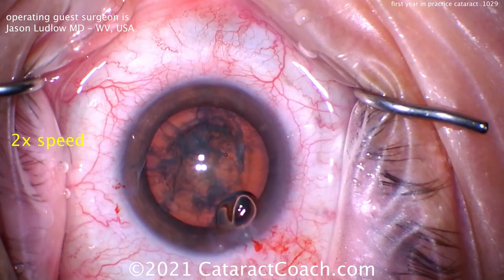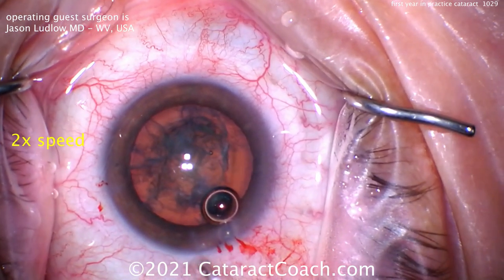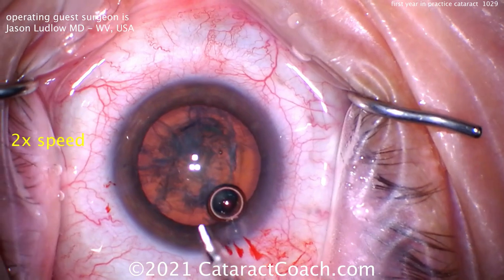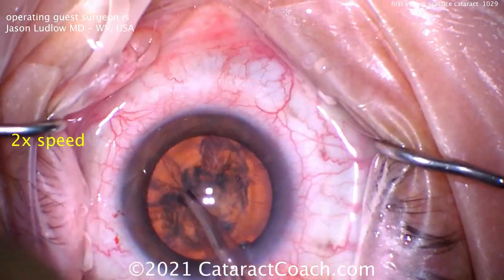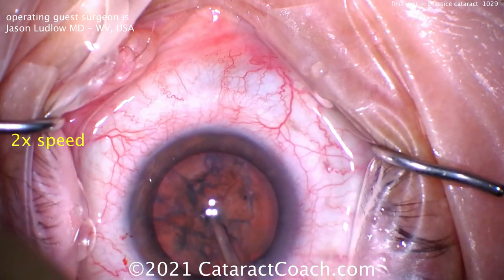Here comes the phacoprobe. A little more dispersive viscoelastic — I like that technique, just a dollop right there in the center. Now here comes the phacoprobe, adjusting the tip and the sleeve. That's actually a very important step. Your technician may not be able to do that for you, especially if he or she is presbyopic. Cleaning up some of the anterior cortical material here.